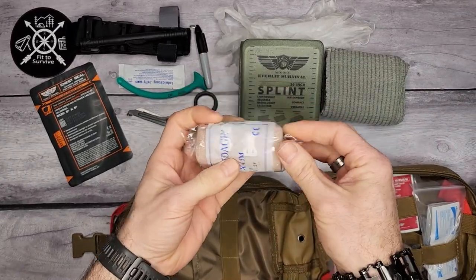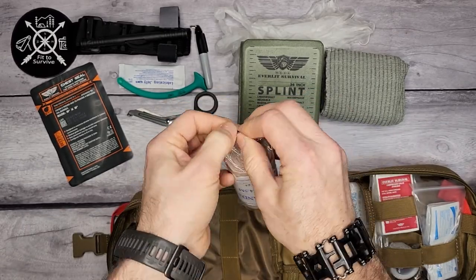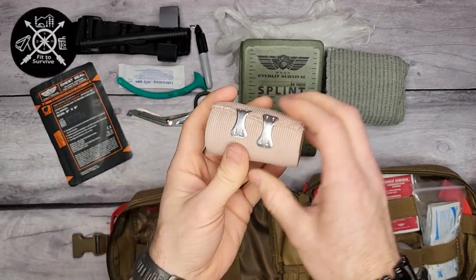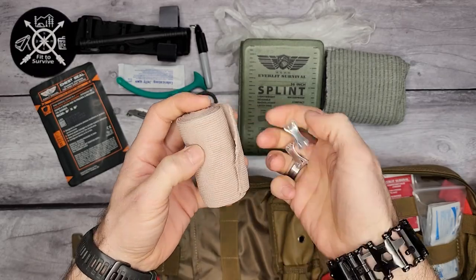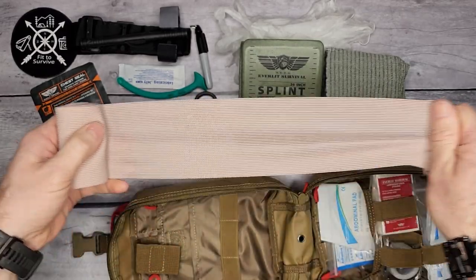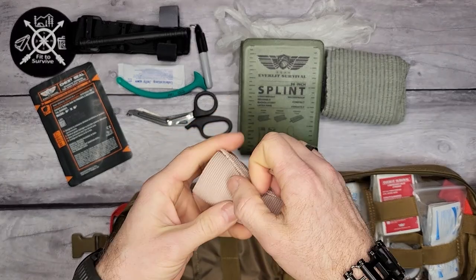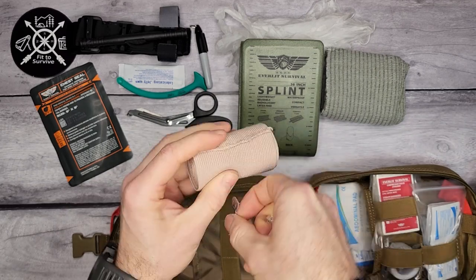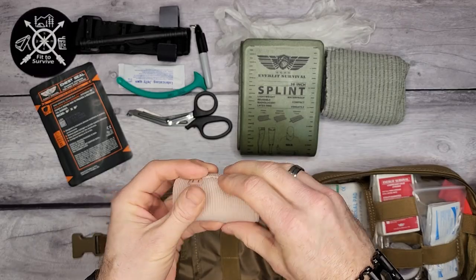Then you have a standard elastic bandage. This is what you'd expect for a sprain or wherever else you need to apply it — to hold gauze or another bandage down. You can apply this stretch bandage wherever needed and use the little clips to hold it in place.